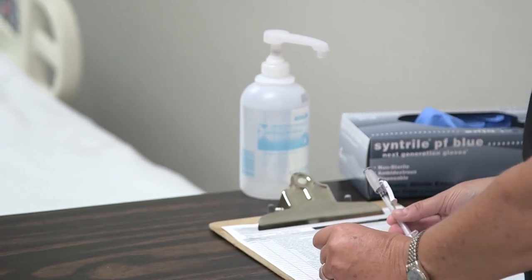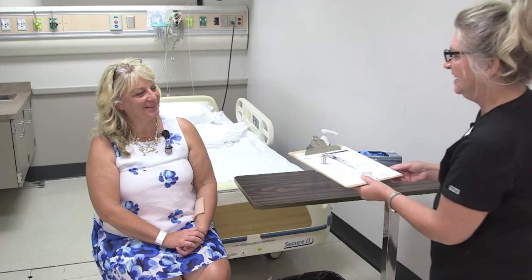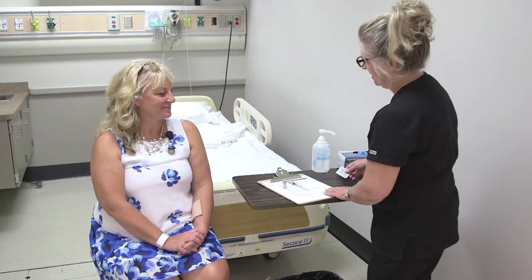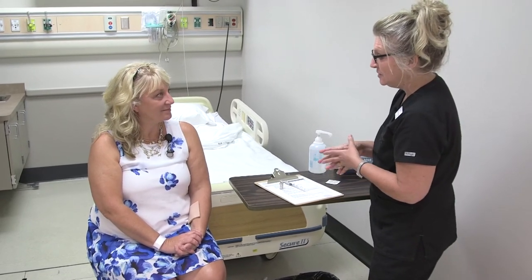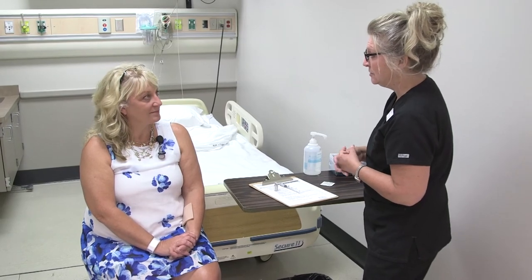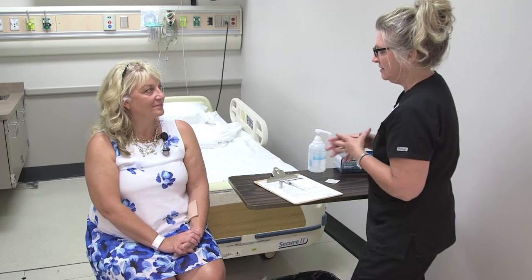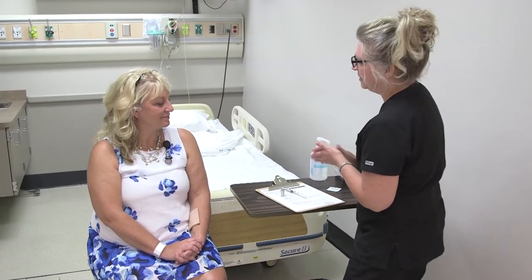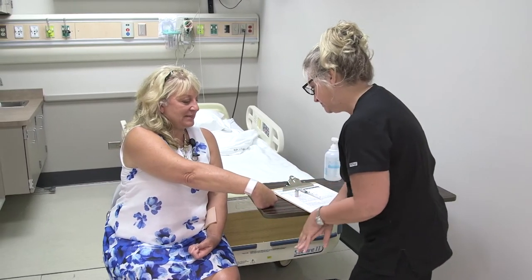Once we have the dose drawn, we do our two medication checks here and our third check will be at the bedside. 'Hi Sylvia, good morning. I'm Mary, a student nurse from CVTC. I'm here to provide you with a tuberculin skin test, which is required by this facility.' I need to verify your full name and date of birth, please. 'Sylvia Vasquez, January 30th, 1966.' That matches my MAR.